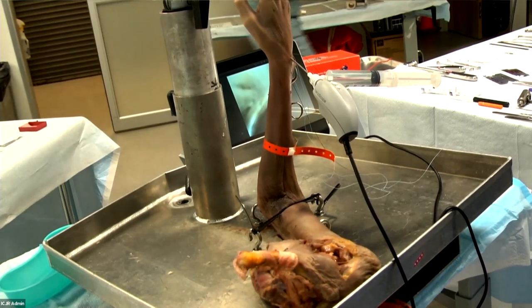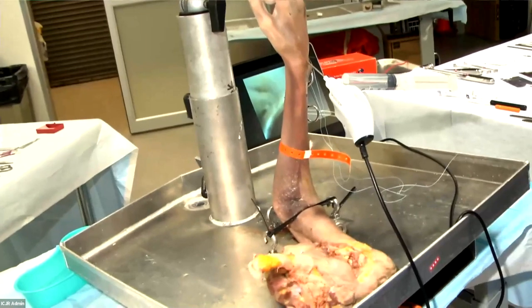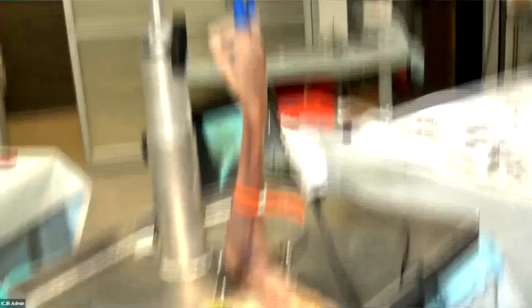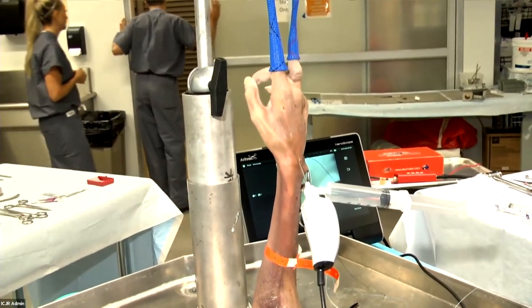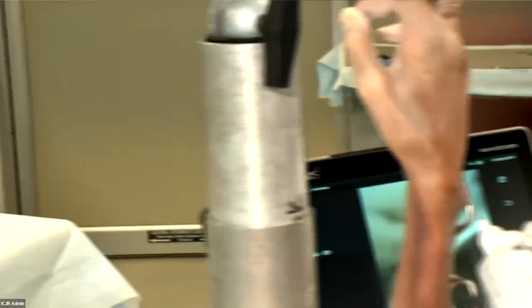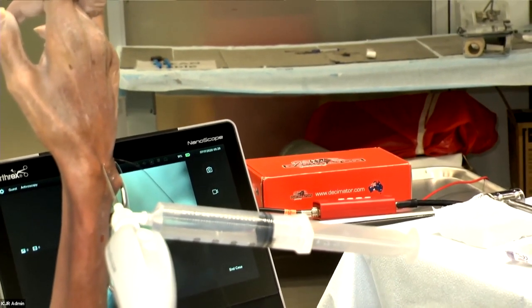In general, doing arthroscopy, there are multiple portals you can use. For TFC repairs, we typically use a 3-4 portal — between the EPL and the fourth compartment extensor tendons — and also a 6R portal, directly radial to the ECU tendon. Other common portals for bread-and-butter wrist arthroscopy include the 4-5 portal and the 6U portal, around the other side of the ECU. There are also some volar portals for unique situations.